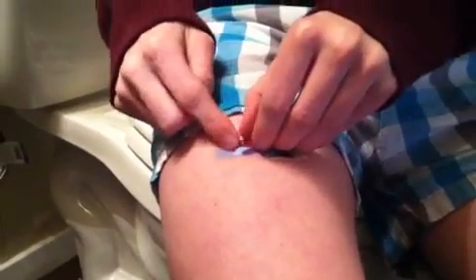But anyways, as you can see, this one actually came out pretty good. Now, they don't always come out pretty good in the end. Sometimes the tea comes back, sometimes it bleeds, and sometimes it just does nothing. That's perfectly normal. You're never going to have a perfect shot. It's not always going to be consistent, and don't freak out if it starts bleeding everywhere. That's perfectly fine. I don't want to worry you. It's not that big of a deal.